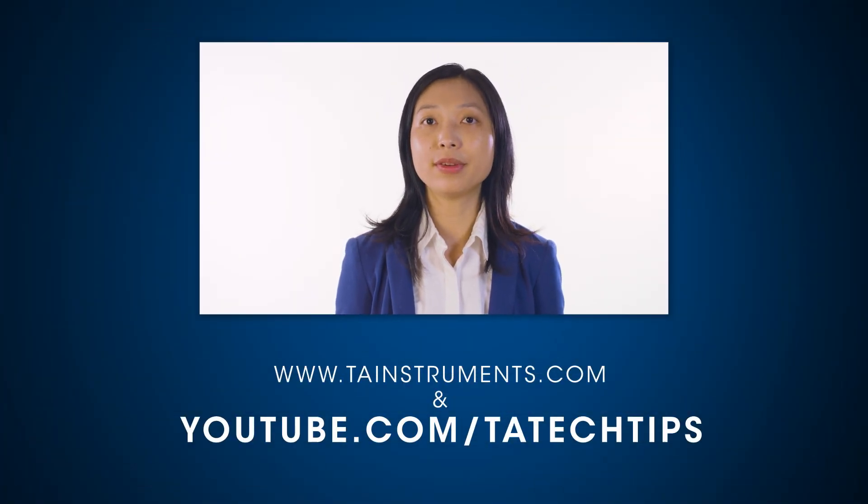In this TA Tech Tip, we covered how to set up the saturated reservoir for the Discovery assay. Please stay tuned for more helpful tips from TA Instruments, and thank you for your interest.